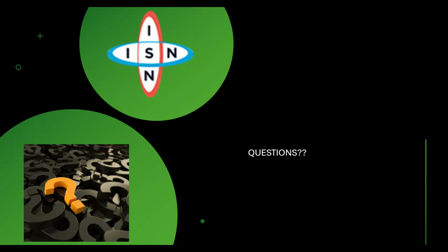Any other question? Hello. I want to ask, when next are we going to have a training on troubleshooting on this equipment?